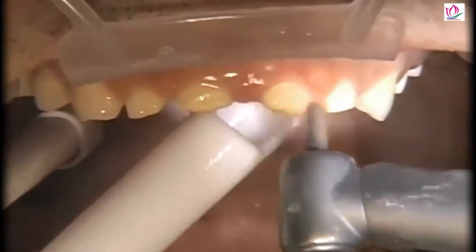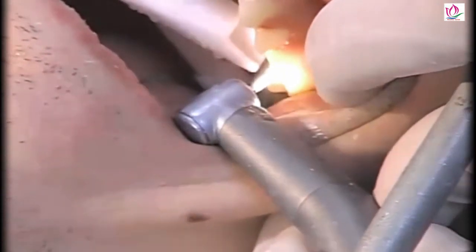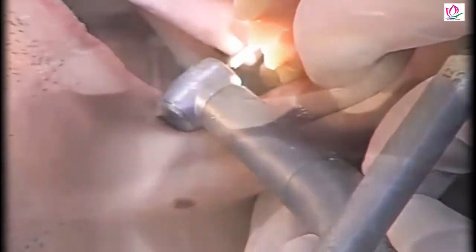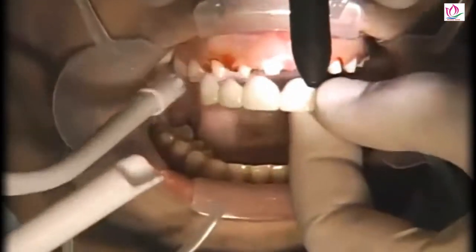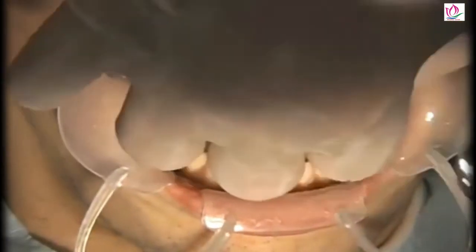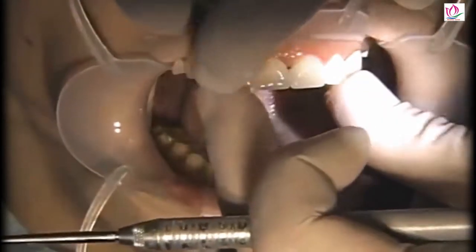Not a lot of preparation is needed on the anterior teeth — certainly no incisal reduction. On a tooth like this where we still have some features, we can go ahead and use our reverse prep technique by starting with the gingival depth cut with the round burr. Once we've rough-prepped these teeth, we're just going to try on the biotemps on the anterior teeth to see how they fit, then continue to make any reduction necessary to get the biotemps to seat passively. You can either look at the biotemps model where they were constructed or have a suck-down splint made if you find that more helpful.